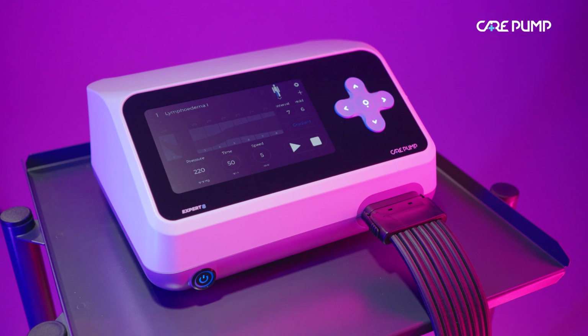Starting and stopping the treatment. After setting the parameters, you can start the treatment by pressing play icon. The currently pumped chambers will flash blue and turn to solid blue light when the set pressure is reached.